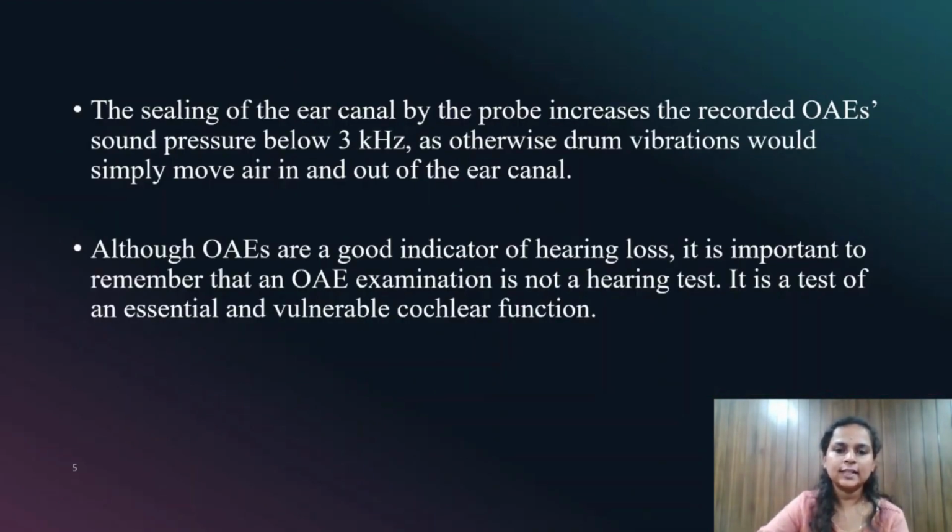Sealing of the ear canal by the probe is very important, which increases the sound pressure below 3 kHz while recording OAE, as otherwise drum vibrations would simply move air in and out of the ear canal. Although OAE are a good indicator of hearing loss, it is not a hearing test, it is a test of an essential and vulnerable cochlear function.